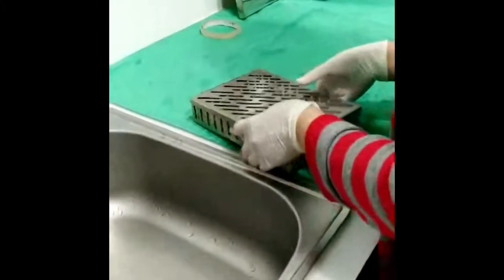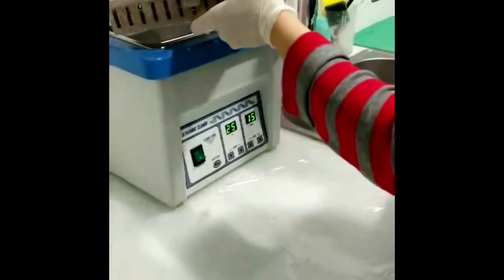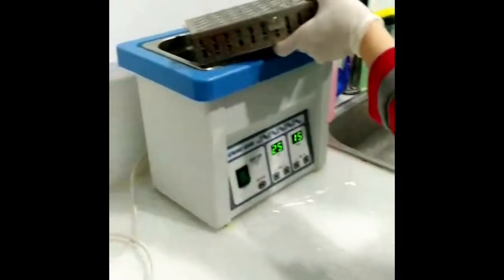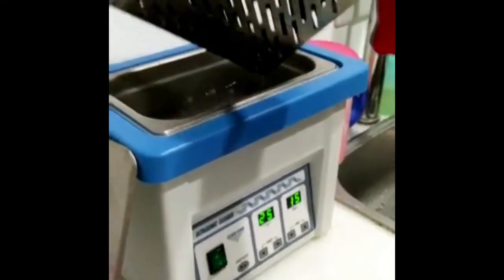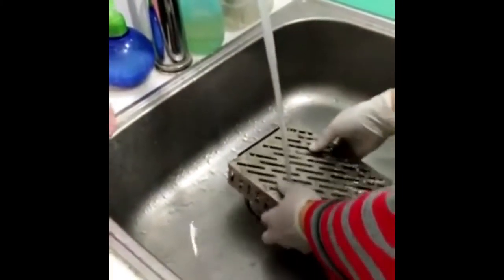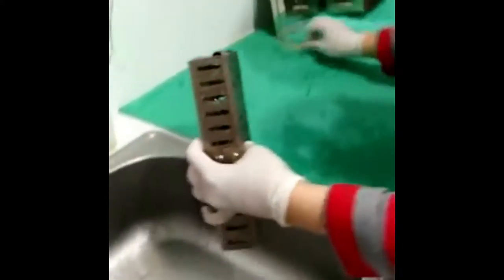After the cleaning is done, we put all materials into the ultrasonic cleaning machine so that debris can be removed even more accurately. After 30 minutes, we take the materials out and briefly wash them.